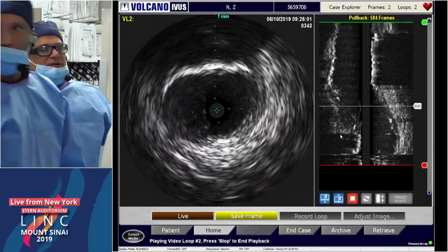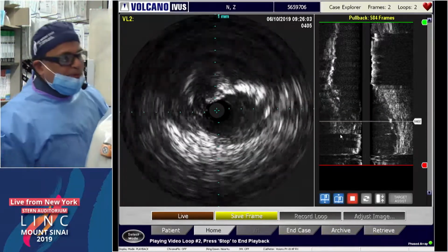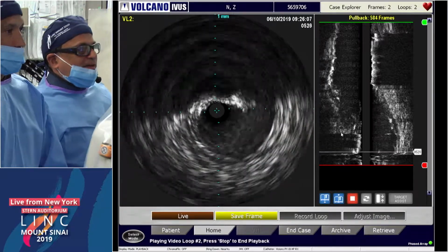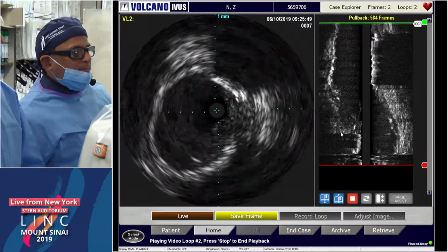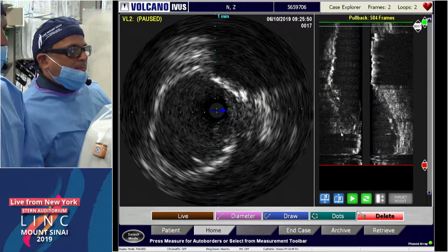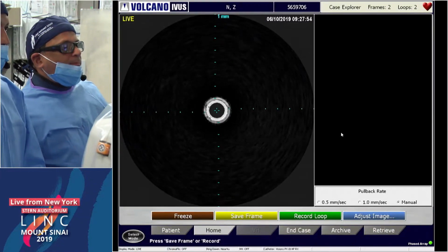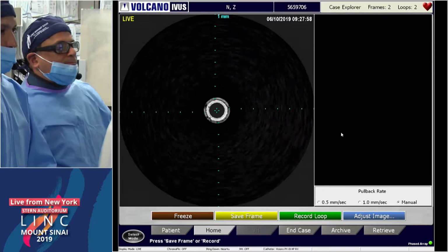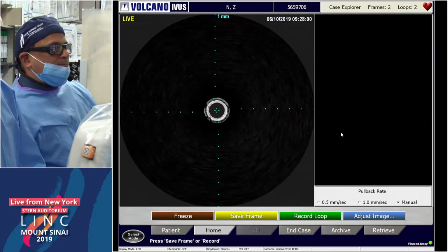Off-road map. The question is, what drug would you use? Do you use a DCB or do you do a POBA since it's a calcified lesion? Look at that expansion, beautiful. I would use a 7.0 DCB, although this is 8. The other option would be lithotripsy, which we didn't discuss here, and maybe there you wouldn't need the distal protection if you're trying to save cost.